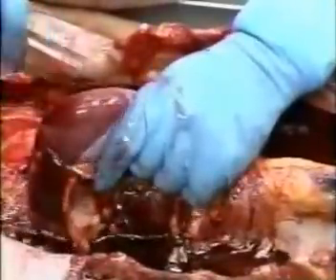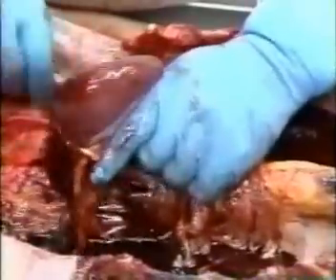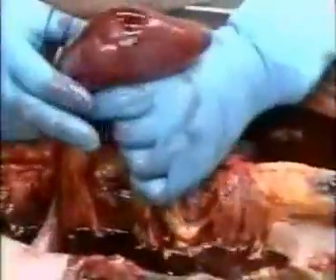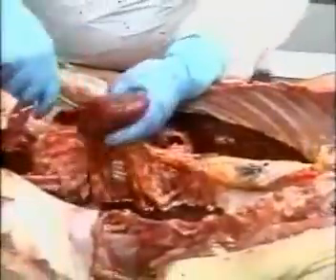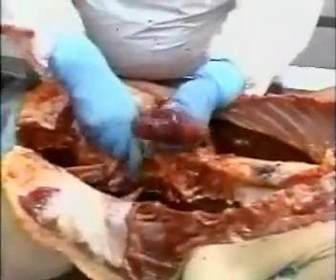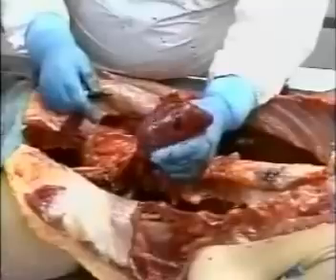Now he's incising the renal capsule, which is a thin membrane that surrounds the kidneys, and he'll strip that back to expose the kidney itself and then remove the kidney.